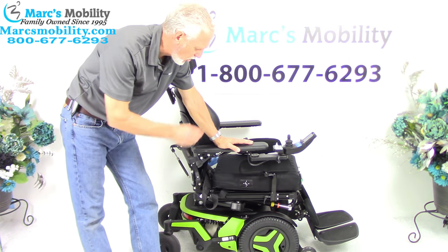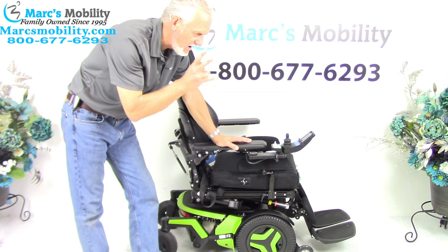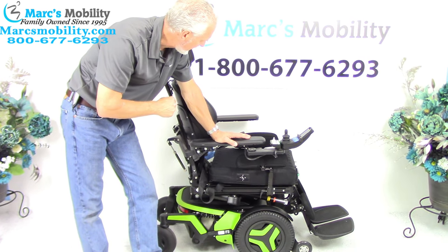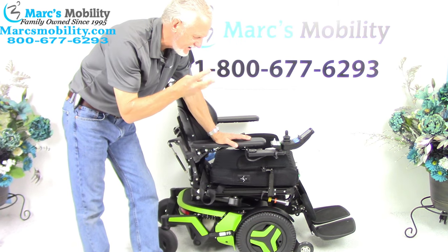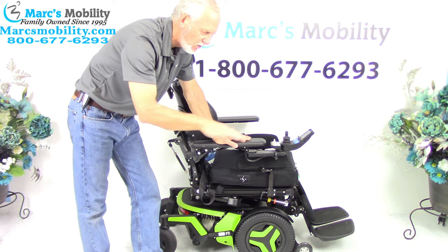We have here a Permobil F3 power chair with only two miles — it's practically brand spanking new. This power chair has three electrical functions: it has the electric tilt, the electric recline, the electric legs, and no seat lift.